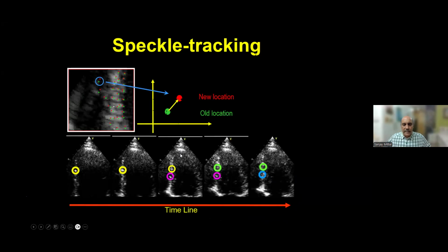The simple principle of speckle tracking is that today's machines can recognize the pattern of the myocardium just like fingerprinting. The finger has all those fingerprints where those small lines are unique for every person. So these machines today identify the relationships of these speckles, dots in the myocardium, and they can track those speckles in the different phases of myocardial motion. So in systole, the normal thing would be that the contraction would be systolic and the longitudinal long axis would also reduce. So if we look at the global longitudinal axis movements, the machines have a way to track these small speckles in relative motions.